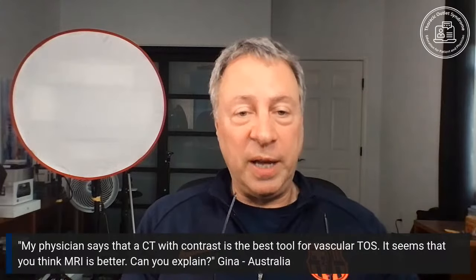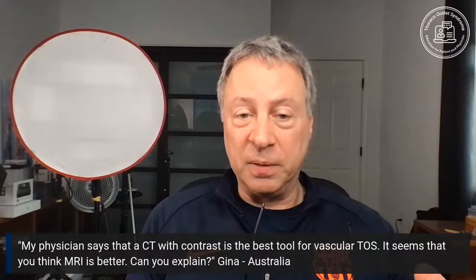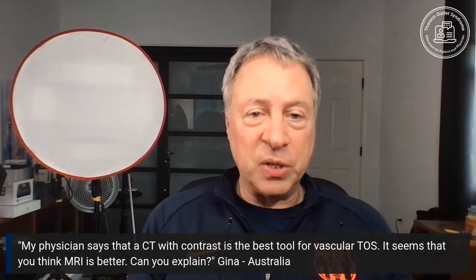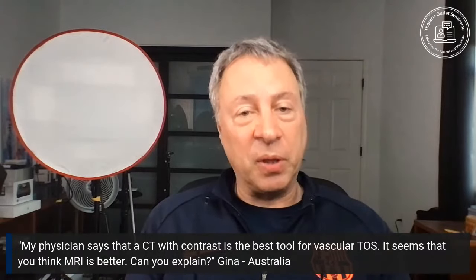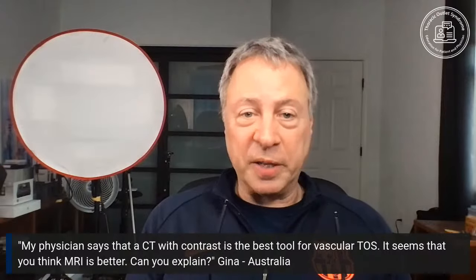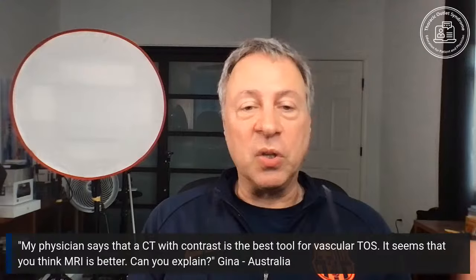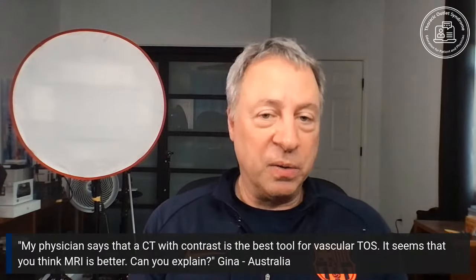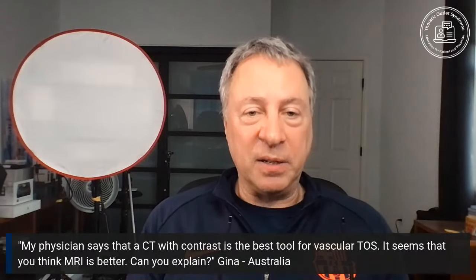So you could look for a little ligament or a fibrous band. You have to look for the rib and the collarbone. You want to look for the scalene muscles. For some docs who don't do this all the time, it's hard to move their eyes from one image to the next and put them together. But I do this all the time. So if I'm interpreting it, MRI for me, to look to one set of images, go back to the other one is a piece of cake. It's what I do. And it does provide more image data in the end.